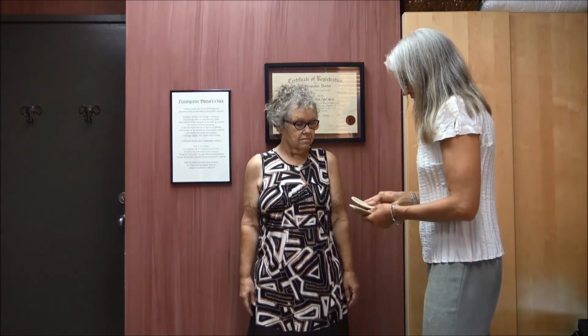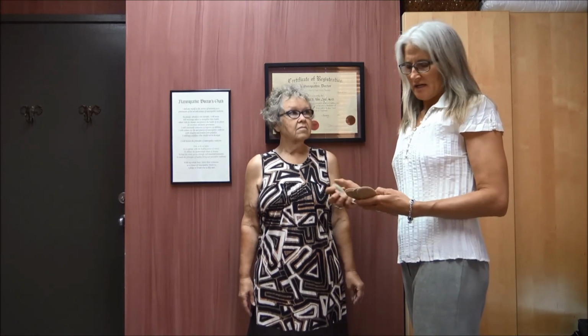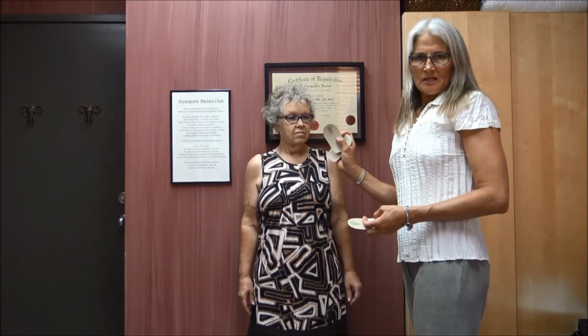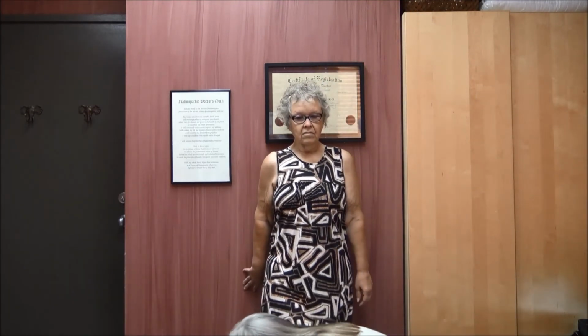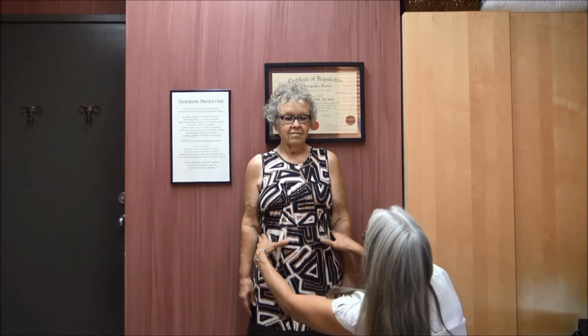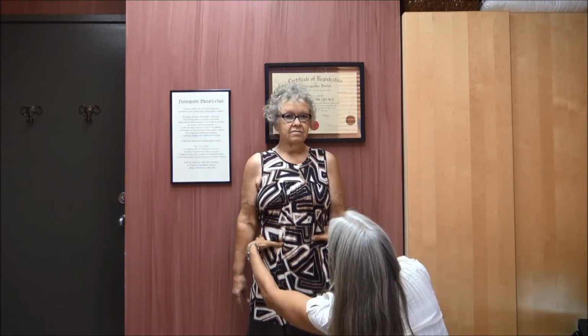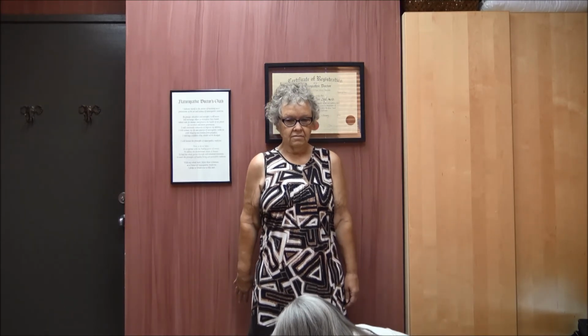More level. Okay, so what I'm going to demonstrate right now is we actually had to use a C lift, which is 1/4 inch for Paulette. I'm actually just going to put in the A, which is 1/8 inch, and show you that it actually wouldn't even her out. With that one, you probably feel like it brought you up a little bit, but not by much. Yeah, I didn't feel much. No, and you can see how she's still uneven with that. So you just have to look to see which one it is.